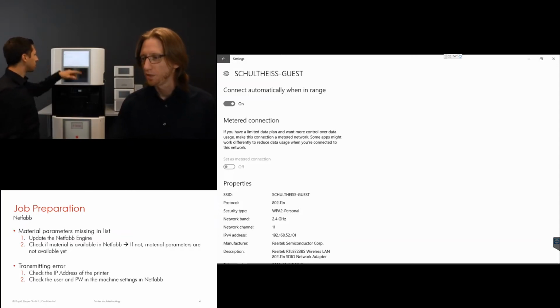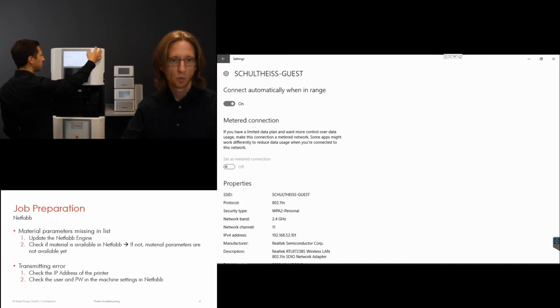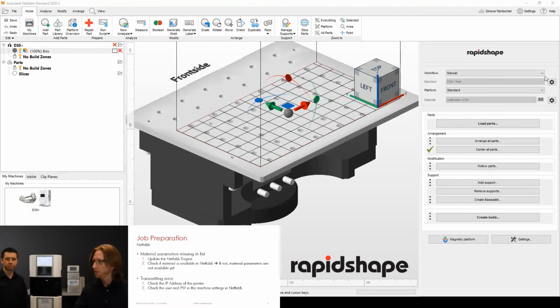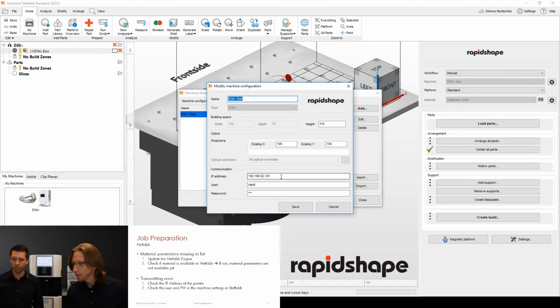52, maybe the 52 was wrong. Let's have a look. So 52, 101. Wrong network. So let's go back to Netfabb. Let me quickly share the screen with you. Let's go back to the machine settings right here. And as you can see, the IP address was actually correct. Okay, that's good. So then we have a different reason for that.